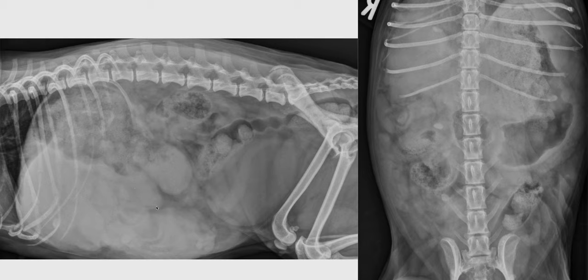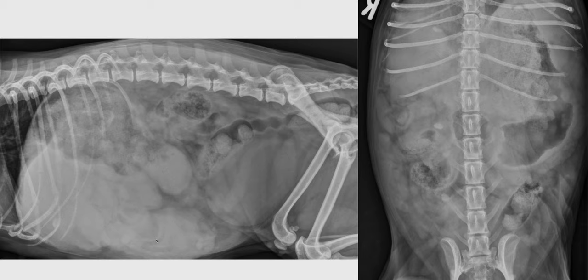Regarding this mass lesion, we have two main differential diagnoses. Either it can be part of the liver mass, which is quite lobulated and displaced caudally, or it could be a separate mass which is partially silhouetting with the liver because they are in close contact. In that case, we would consider most likely a splenic mass lesion, as it's quite common to see splenic mass lesions at that level in the abdomen.